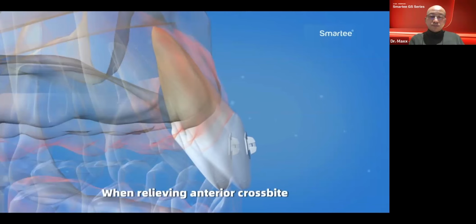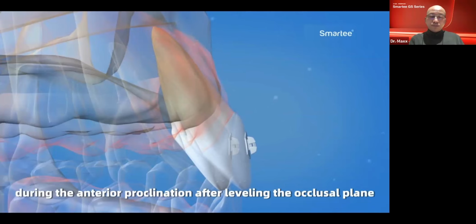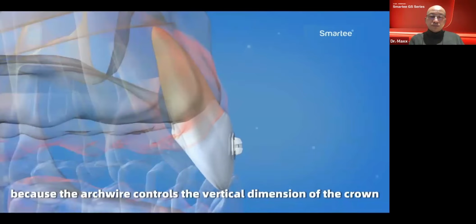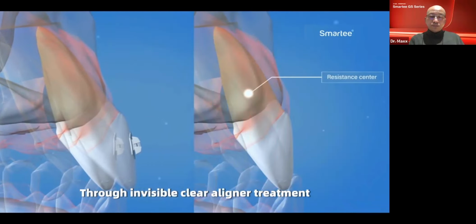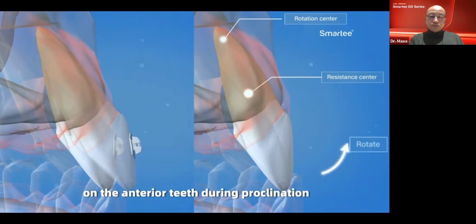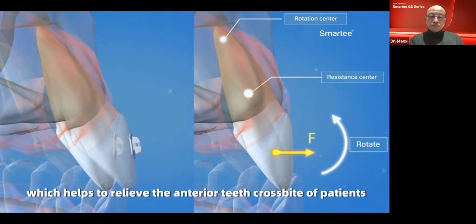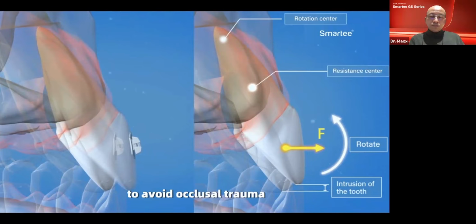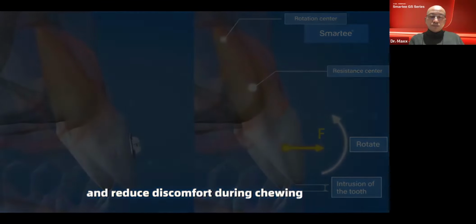When relieving anterior crossbite using traditional fixed orthodontics, during the anterior proclination after leveling the occlusal plane, anterior extrusion is inevitable because the arch wire controls the vertical dimension of the crown. Through invisible clear aligner treatment, there's a significant relative intrusion on the anterior teeth during proclination, which helps to relieve the anterior teeth crossbite of patients in the early stage of orthodontic treatment to avoid occlusal trauma and reduce discomfort during chewing.